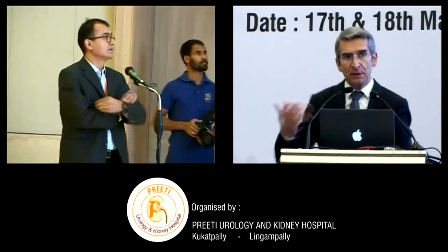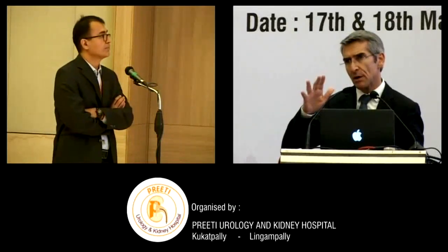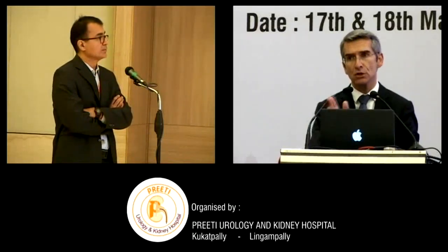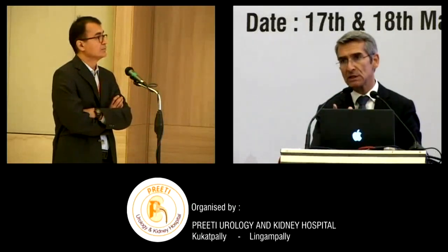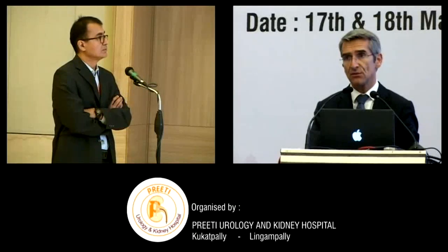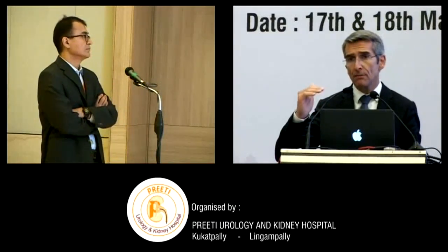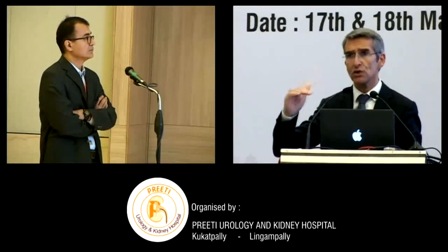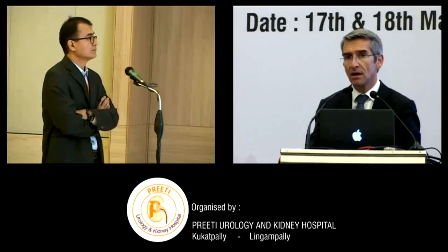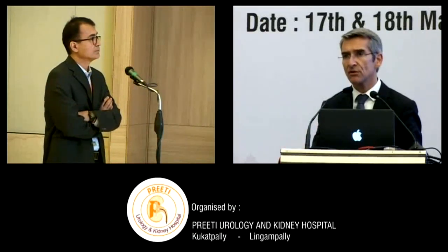Yeah, as I said, my clinical experience is relatively limited actually. So in terms of parameters, maybe we will have to adjust. My feeling with thulium is also that we will probably use it less for fragmentation, but much more for dusting or micro dusting possibilities. And of course, we will have to adjust, as you said, the endoscopic view is something essential when we treat stones, but also with holmium. For holmium, for example, it's very difficult to keep very high frequency parameters. Regularly, you have to stop because the vision is not clear. And again, with thulium, we will also have to define the best parameters to be the most efficient regarding visibility. But today, it's a bit difficult for me to give stricter recommendations.